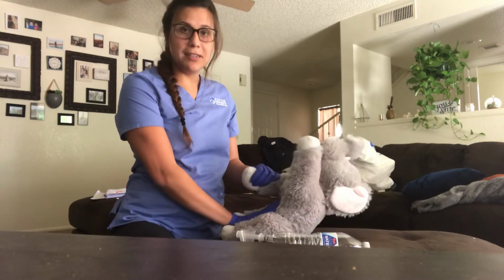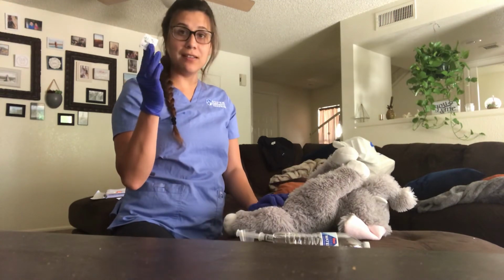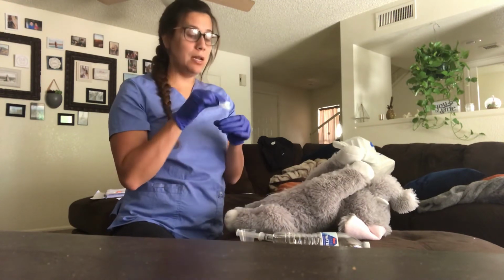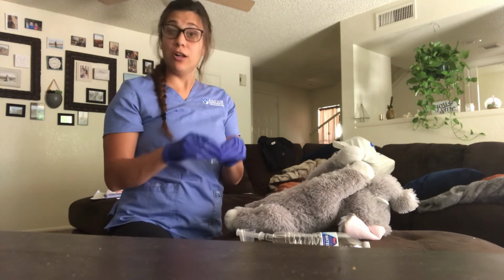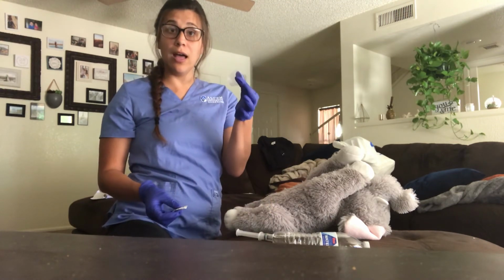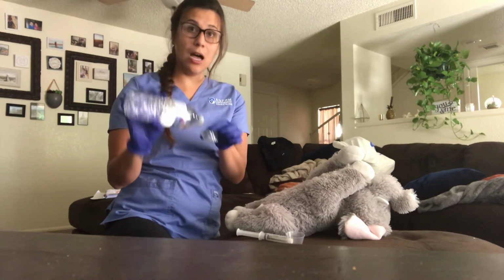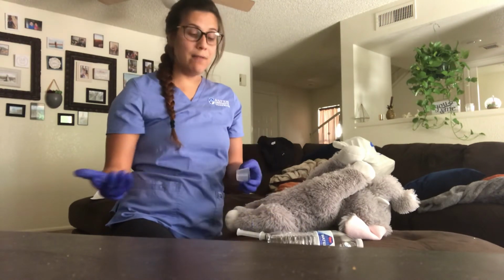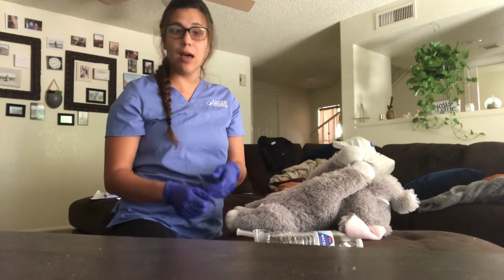My patient's not going to stay up, but you would want to go ahead and crush these. So you would put it in a little pill bag, and then you'd put it into the crusher and you would crush the medication. You would then put the medication into a little cup, and then you would put the sterile water inside the cup. Now, if you have like a capsule, you don't have to crush it. You can just open it up and put it into the cup.